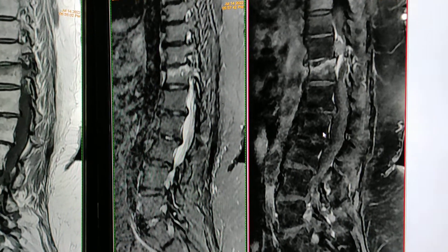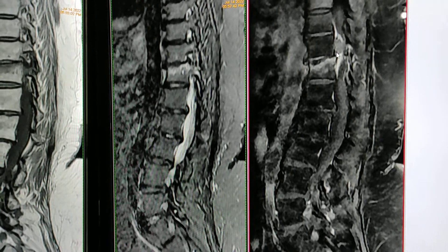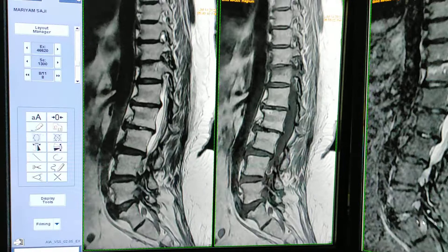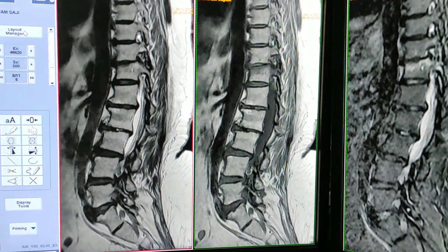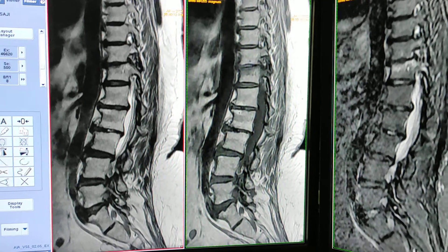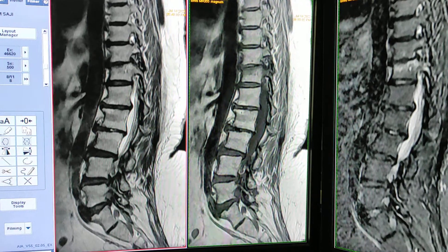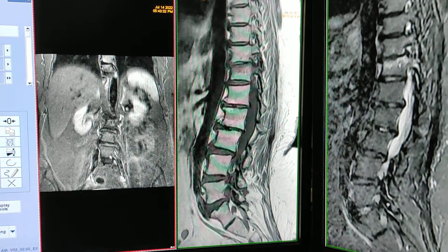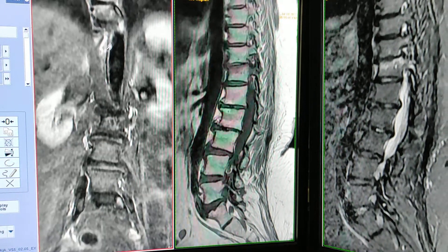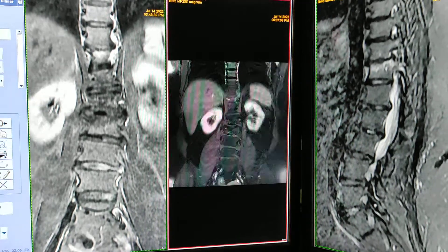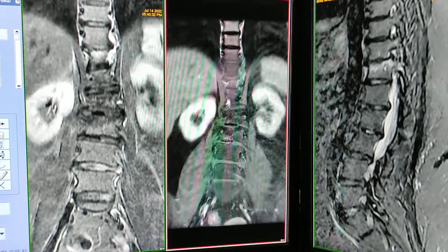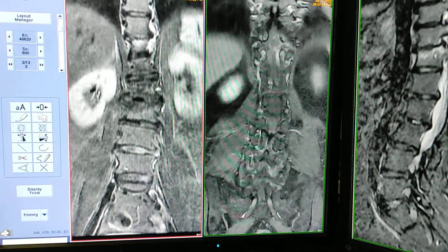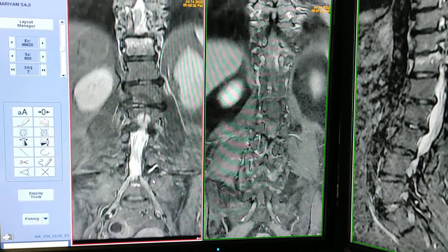T1 fat-sat post-contrast enhancement is seen in this lesion. I am showing you the sequences: coronal STIR, axial T2, axial T1, and axial post-contrast. This is the coronal STIR sequence — here is the lesion.